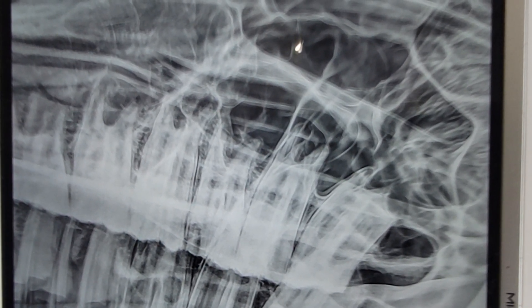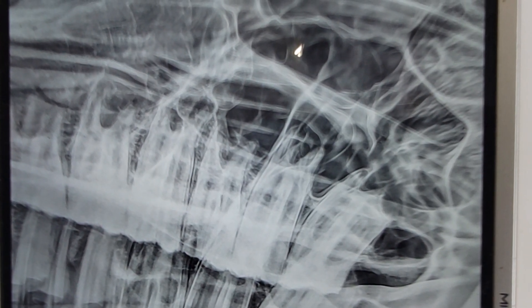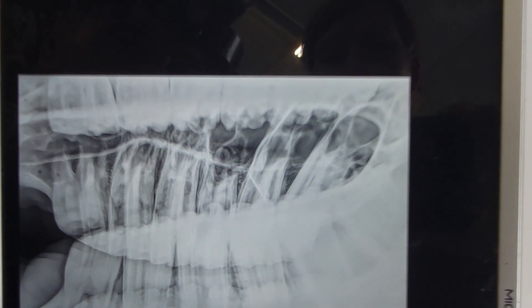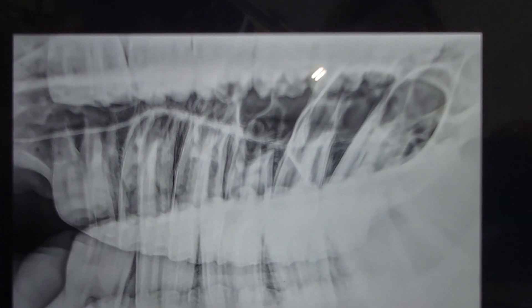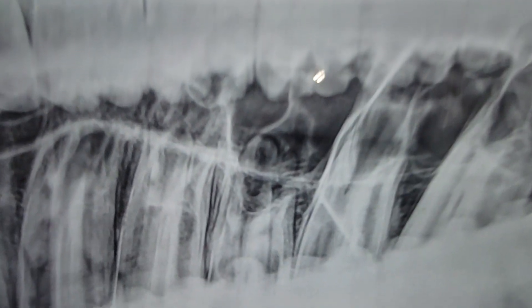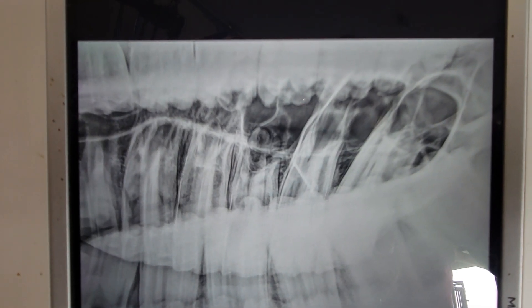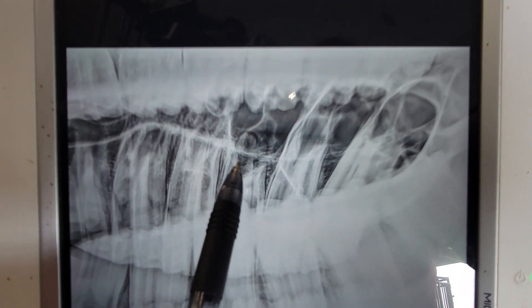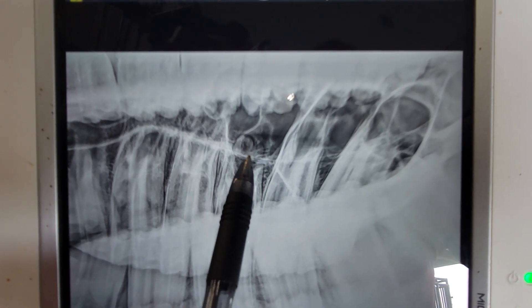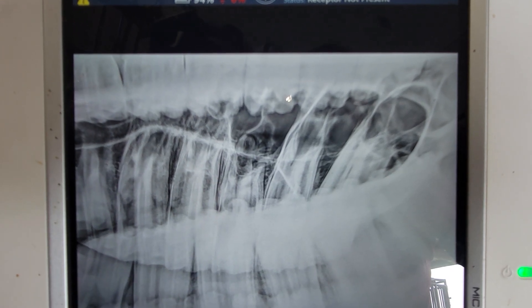A lot of times people might be tempted to stop at that point. But it's really important to do a palatal view. We've explained it in a couple other videos. This is very important on these types of cases because here, if we look at the palatal root, you can see that we have some lysis, maybe even a little cementoma, and we have some definite abnormalities on the palatal root.